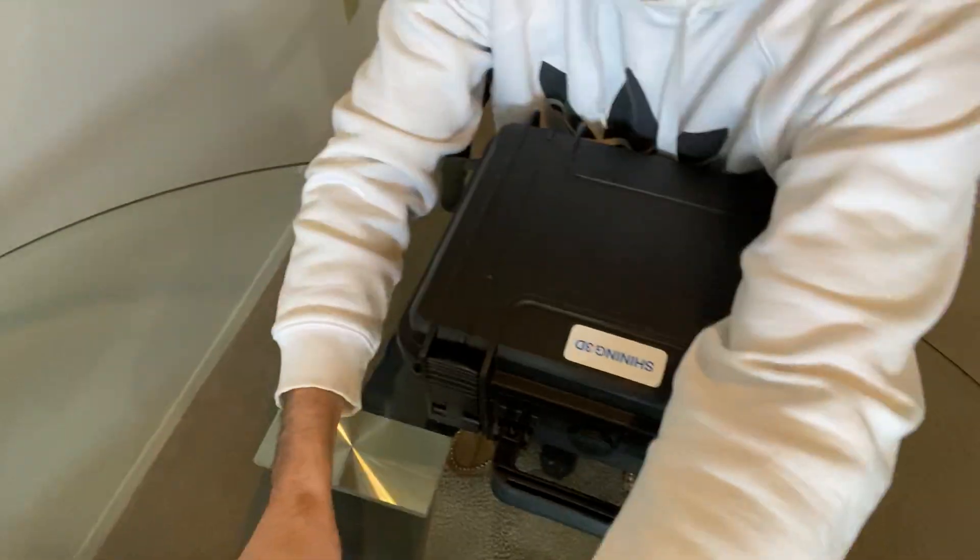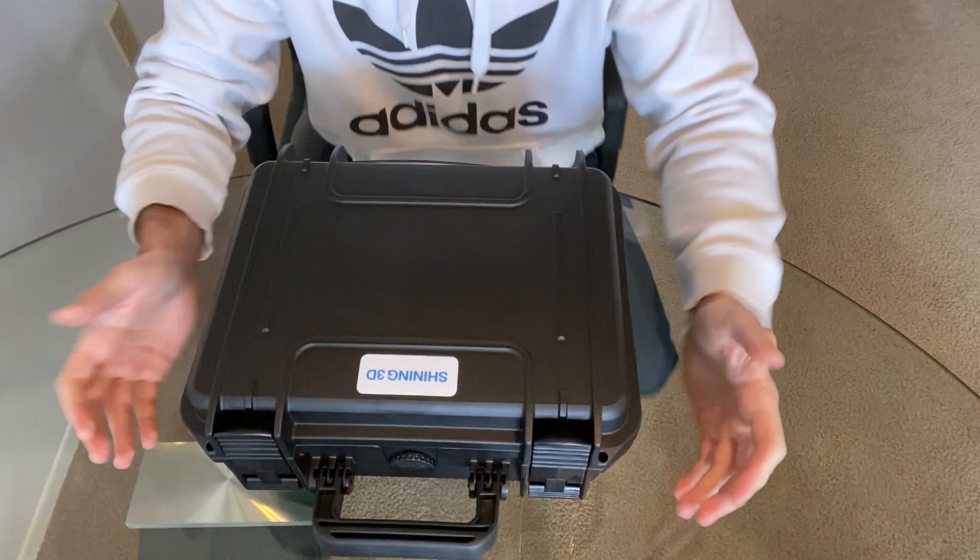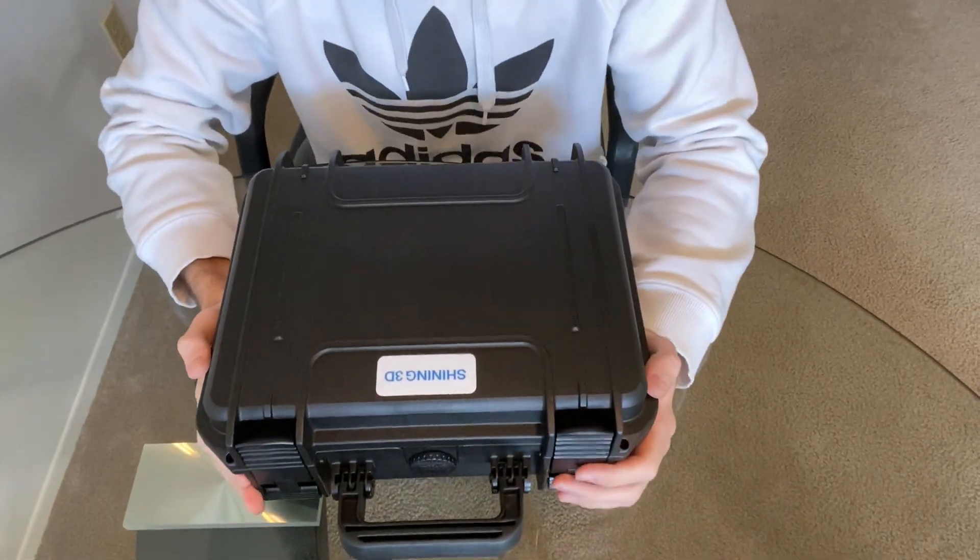Hey, what's up everybody, this is Nick with cadray.com and we're about to do an unboxing video of the Shining intraoral scanner. After you get this dropped off by us, you pull it out of the box — this is it.